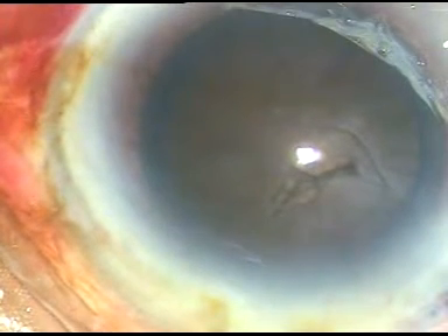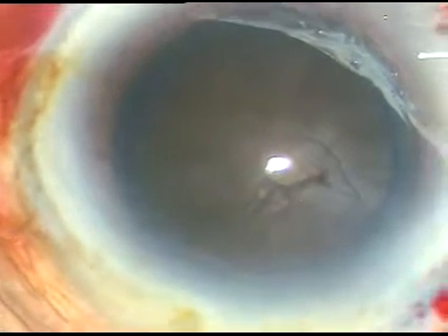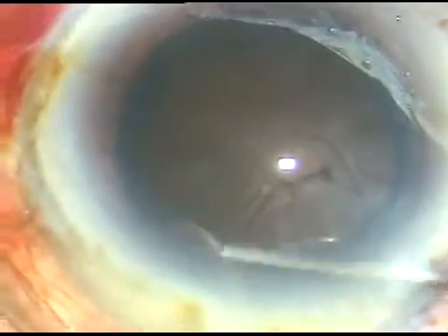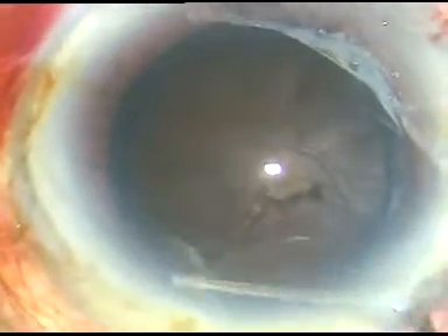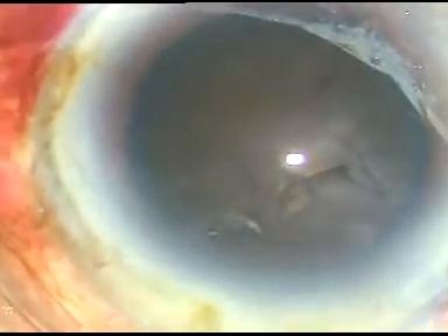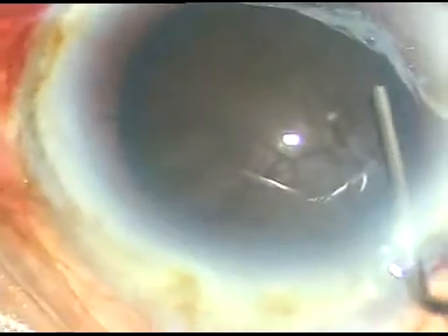Now I want to de-bulk this hard nucleus and make it weak. Hydrodissection is done before that. I cannot see the fluid wave going from one side to the other, so I have to be very cautious.